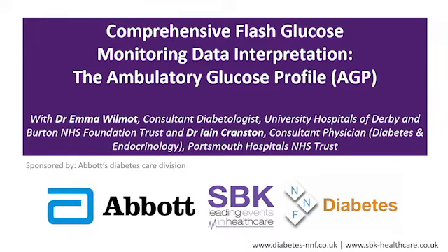So I think this idea of making sure that we do a quick set of validation checks as we go through is important, including checking that this is really the date period that I'm expecting, because most of us will just automatically click into the most recent profile that we can see and say that's the one I'm going to look at. But actually the most recent profile that's sitting on the cloud system may not be the most recent profile that's been collected, depending on what their connection has been like, etc. Yeah, completely.